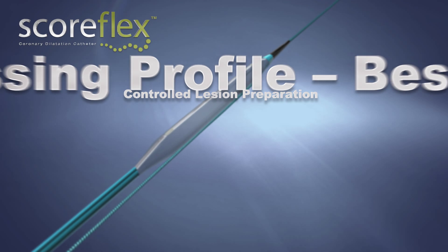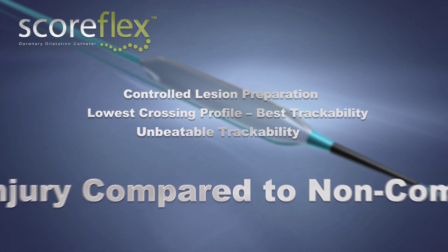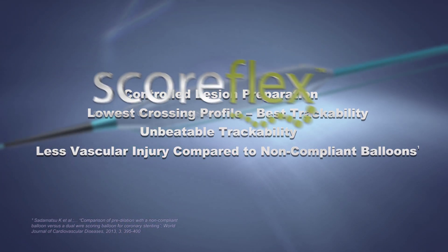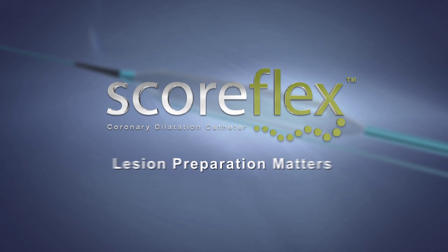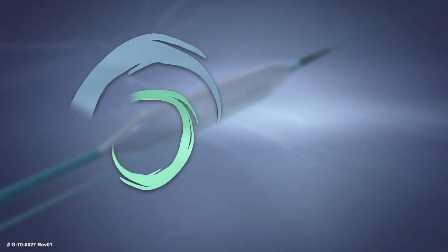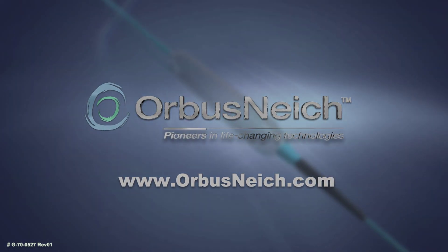The ideal balloon for effective, controlled lesion preparation, due to its low crossing profile and excellent trackability, and less vascular injury compared to non-compliant balloons. Lesion preparation matters. For more information, visit www.OrbusNeich.com.